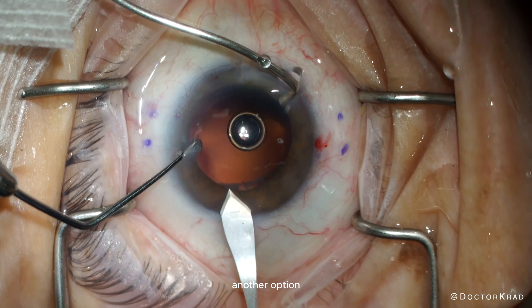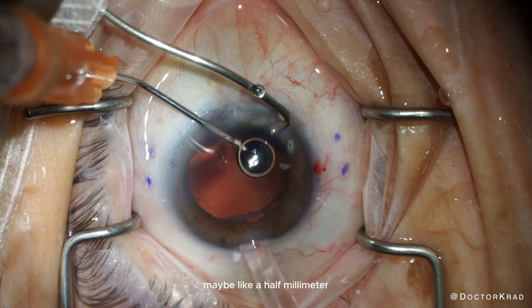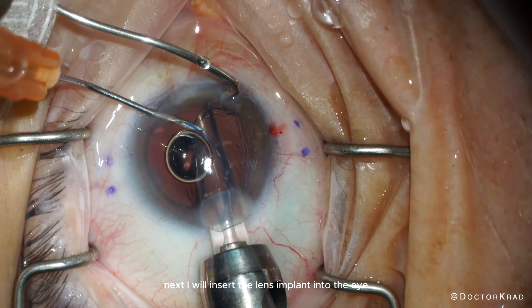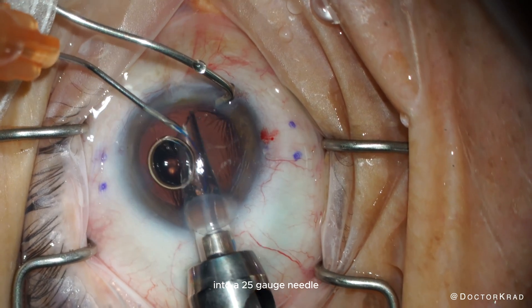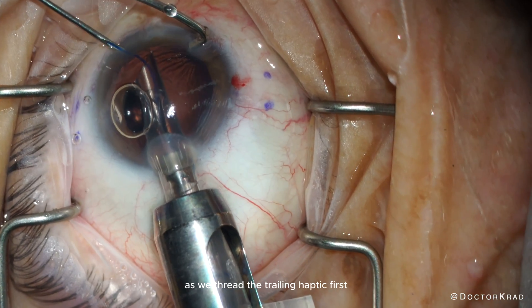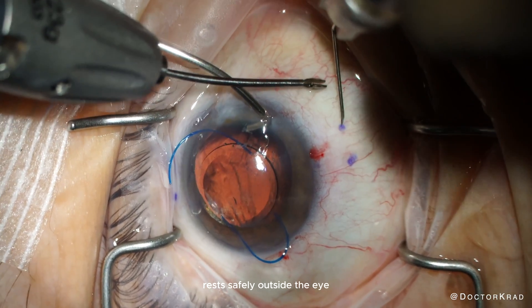In hindsight, another option would be to make a very small paracentesis — maybe half a millimeter — so the irrigation cannula fits more snugly. Next, I insert the lens implant into the eye, externalizing the leading haptic into a 25-gauge needle. This is the Kim modification of the Yamane technique. I like this technique because we thread the trailing haptic first while the leading haptic rests safely outside the eye.